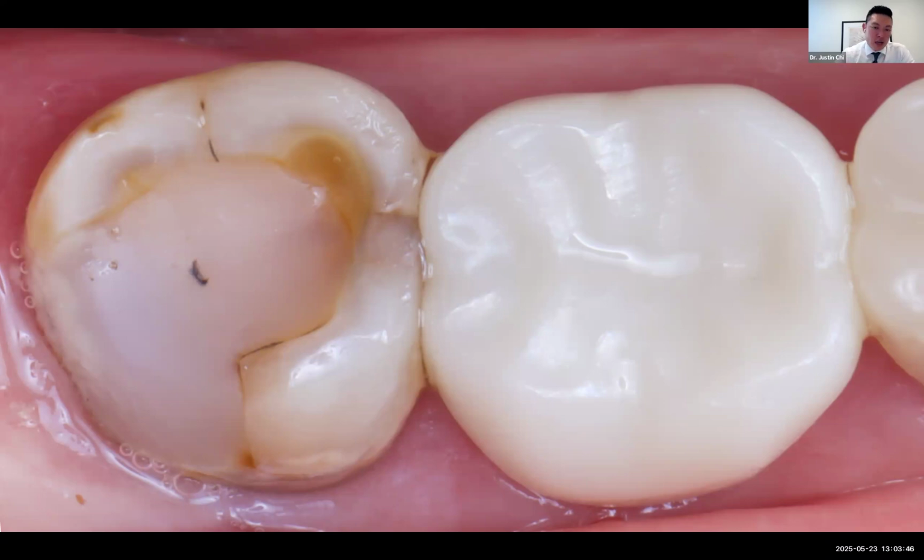The rest of it, the tooth side, can be the same, your preference: total etch, self-etch. Again, that's kind of up to you. But the really key thing is air abrasion, clean zirconia, and phosphate primer.